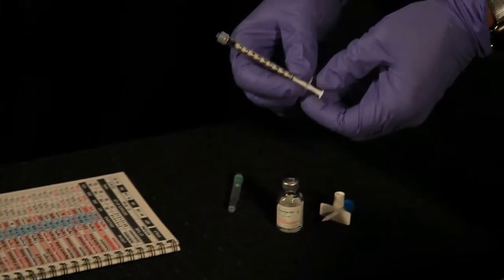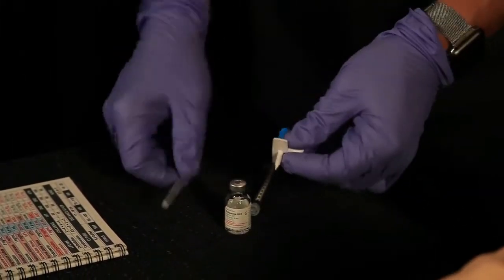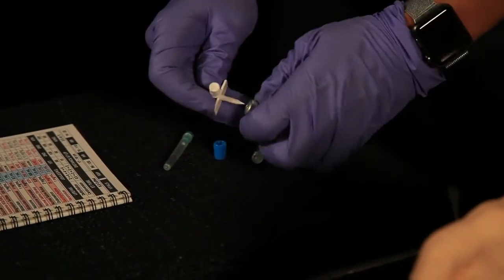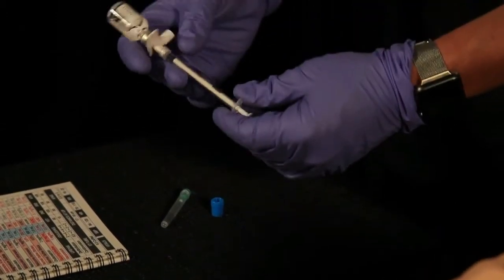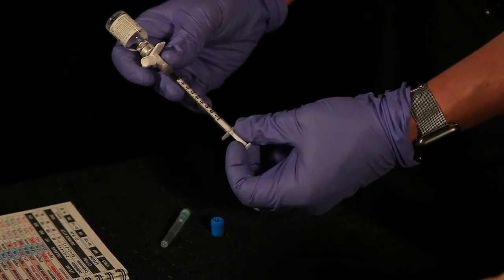So just like pain management, we're always going to use the 1 cc syringe. You have the 2 options to insert into the vial to actually get the medication into the 1 cc syringe. I'm going to choose the mini spike. I prefer to go needleless whenever possible. And then we're going to draw up 0.25 mLs, which is going to equal our 25 milligrams.